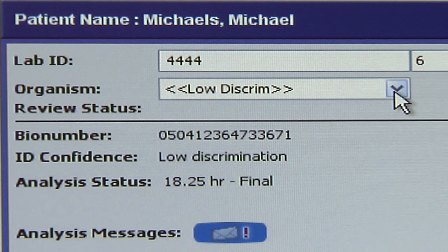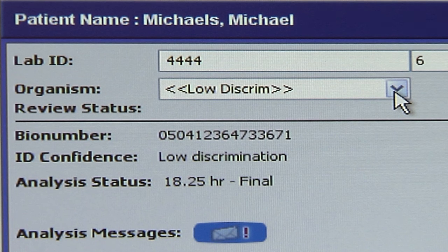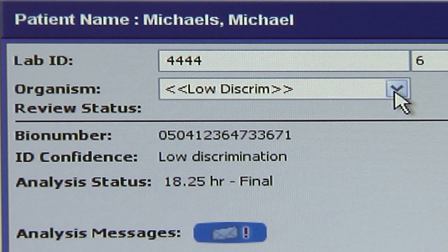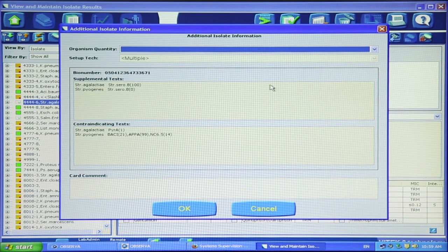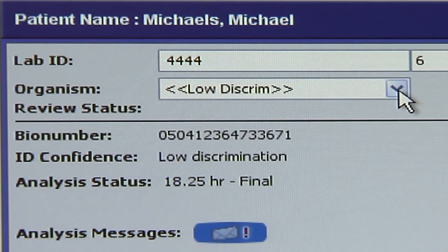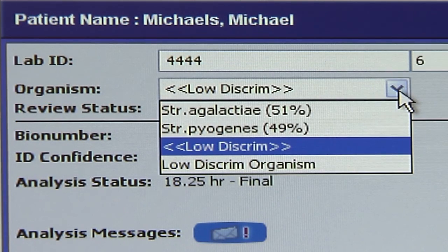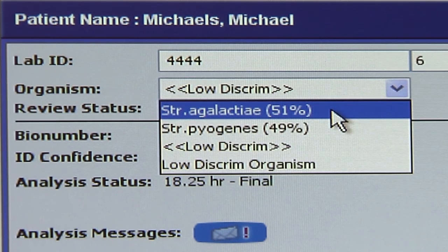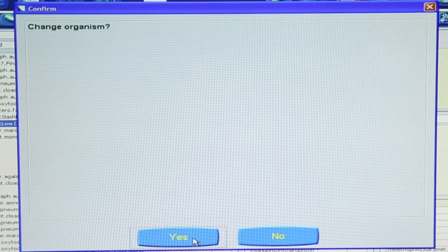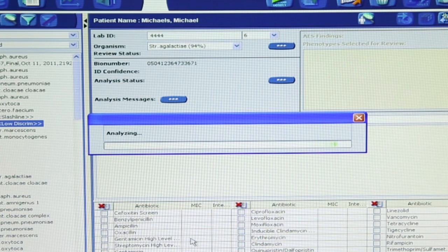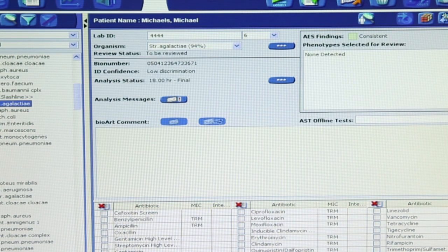Third, is low discrim displayed in the organism field? When the reactions are not sufficient to discriminate between two or three organisms, low discrim displays in the organism field. Percent probabilities will reflect this ambiguity and offline supplemental testing may be indicated. The identification must be resolved to mate with the susceptibility card. Click in the organism field to display a drop-down list of the organism choices, click to select the appropriate organism, and the software will analyze the results automatically.